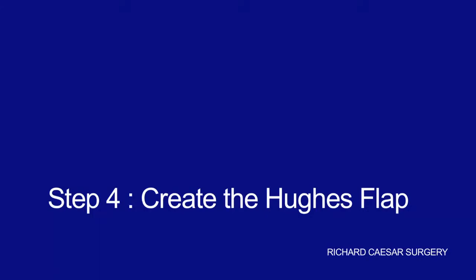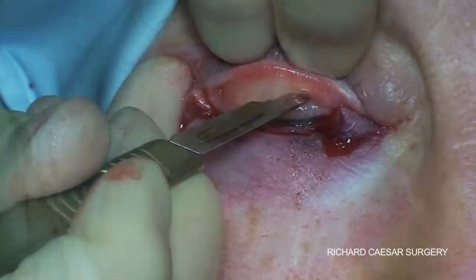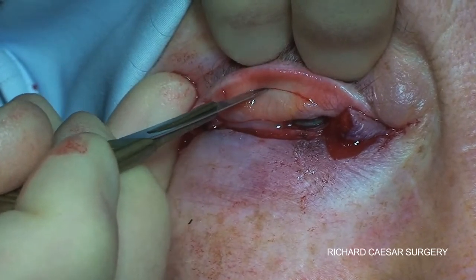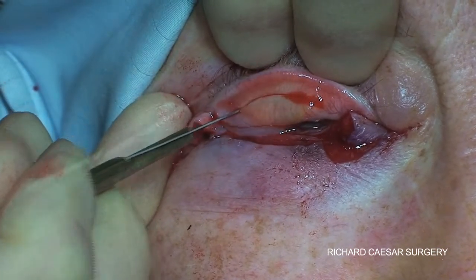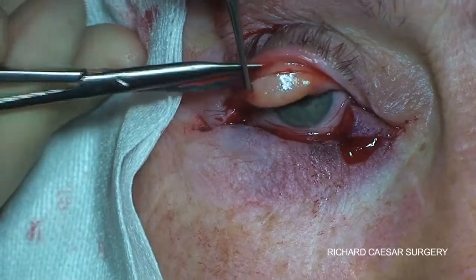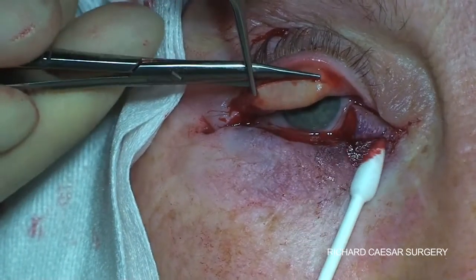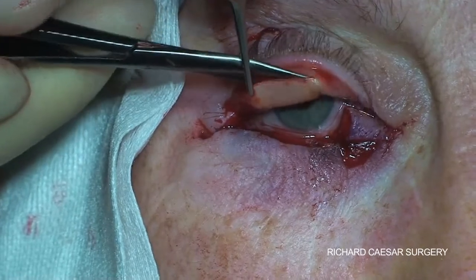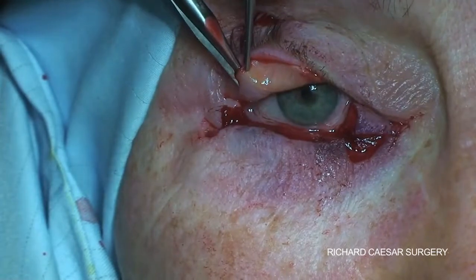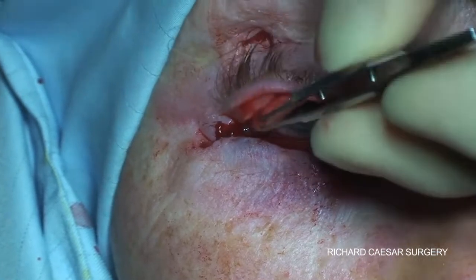The creation of the Hughes flap is always the same. The inferior 4mm need to be left behind in order to provide structural support to the upper eyelid. Once in the plane posterior to the everted tarsal plate but anterior to the non-everted plate, you simply trim off the full thickness and then make relieving incisions at each end.